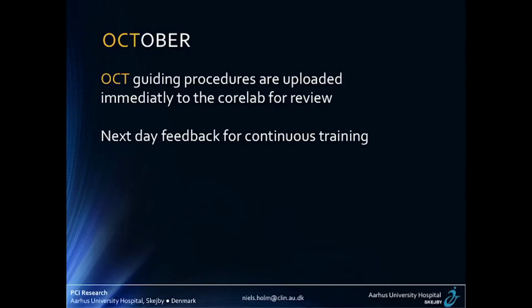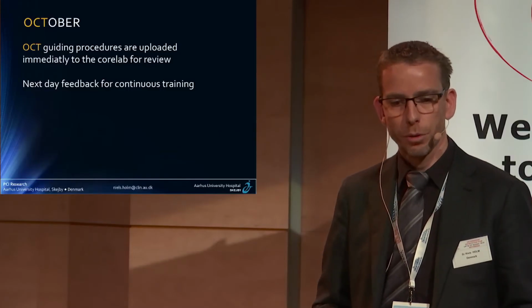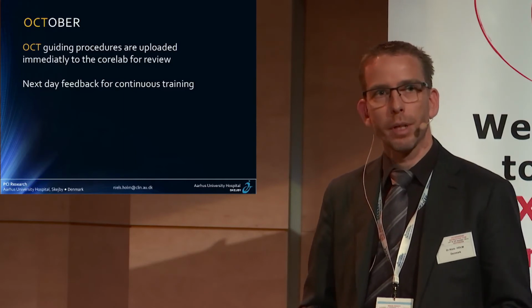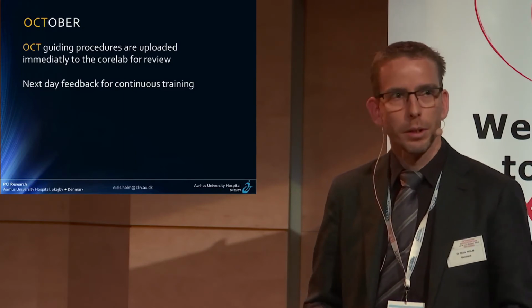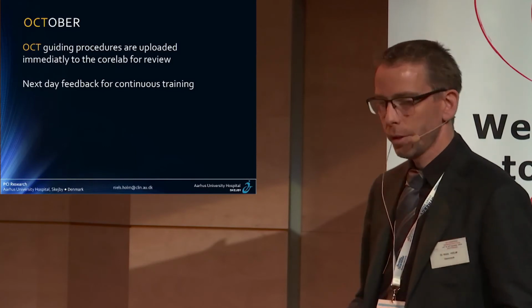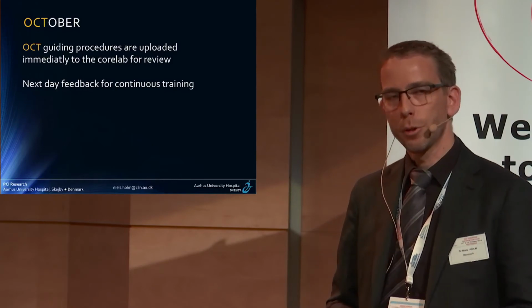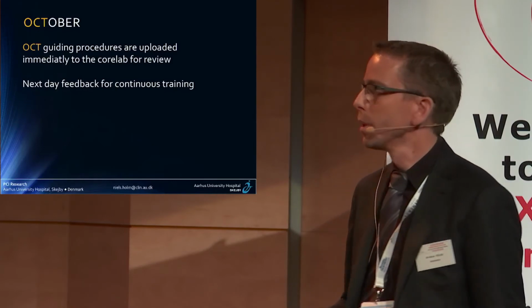And then we have added a next day feedback, meaning that after the procedure, the OCT and angiography is uploaded to the core lab for immediate evaluation, and then they will have, so to say, next day feedback on if the operator could have optimized it even further, both the use of OCT, but of course also the PCI result itself. This of course will only pertain to the OCT arm.